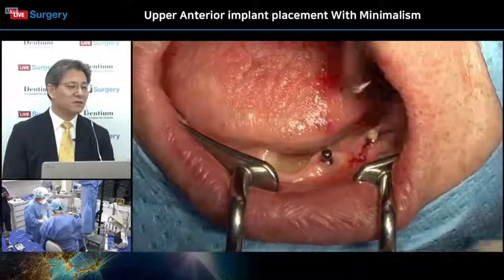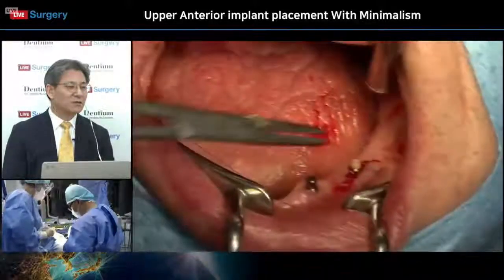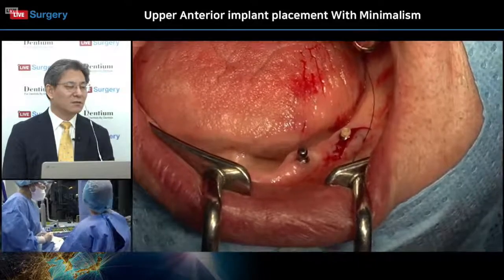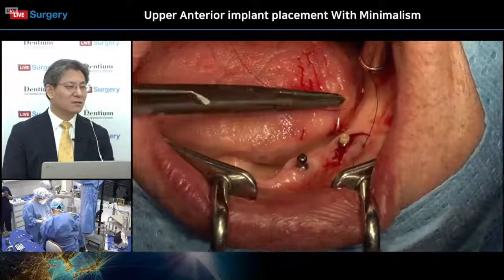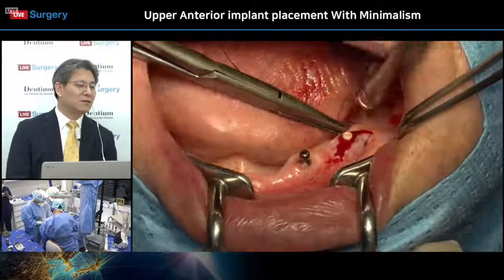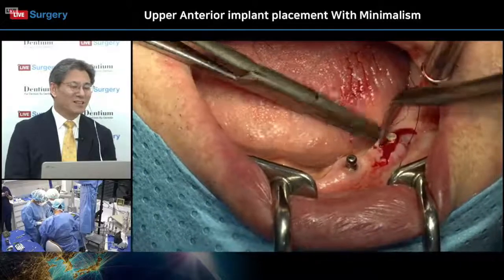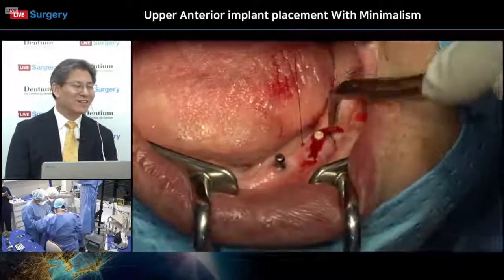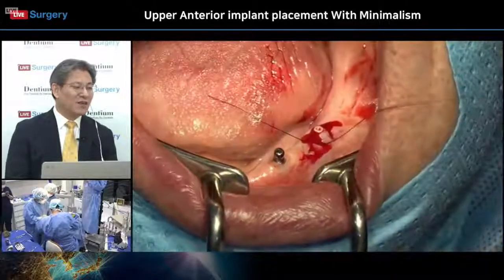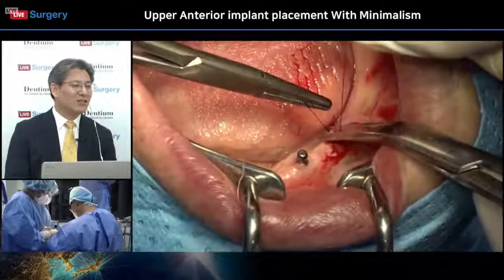Impression, with the prepared denture. Today I will take impressions. Apparently I need to change to a longer one. Yeah. Is taking an impression good today, or next time? What do you think, Dr. Lim, about taking a bite tray impression after the sutures? Yeah. We can consider the impression of the upper anteriors, why not? It actually depends on you, but in my opinion, what about today's impression? Yes. Yeah, taking the impression today. Even though the procedure is not complete, I think many patients and many doctors want to see the bite tray registration procedure.